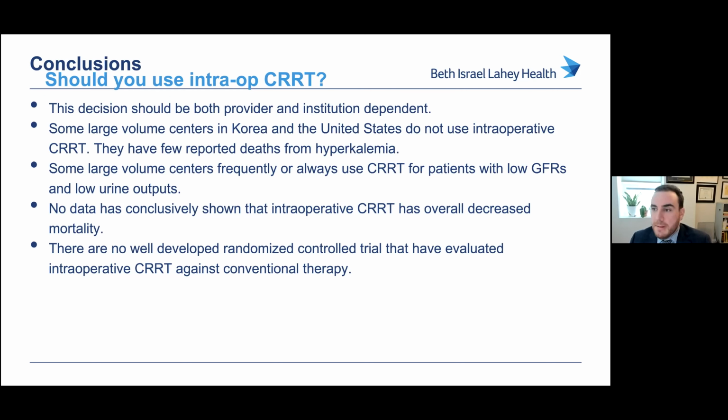Okay. One additional question: if we place the dialysis line in the groin, how do you manage CRRT during cross clamp? You stop and restart? So we stop. It's hard to restart it. The filter clogs. So we would stop it at that point, and we would use it up until reperfusion, until the anhepatic phase.